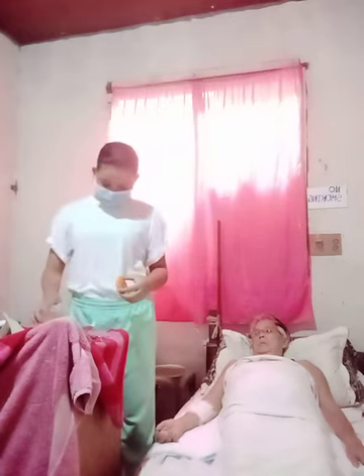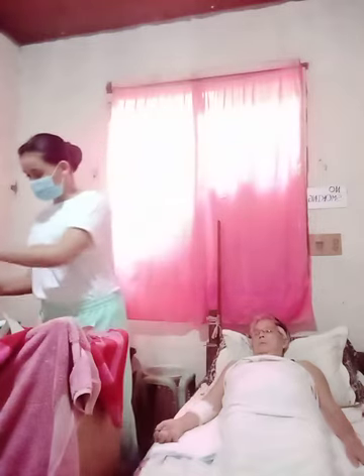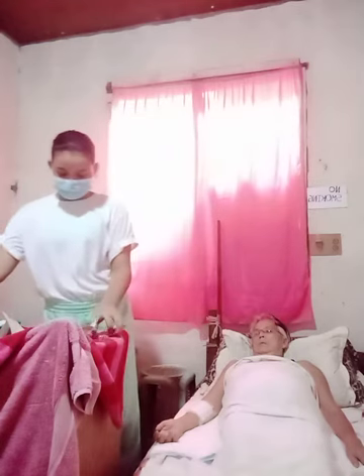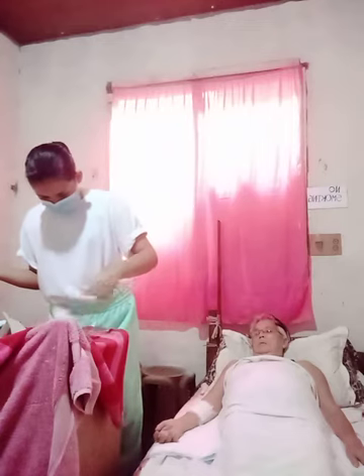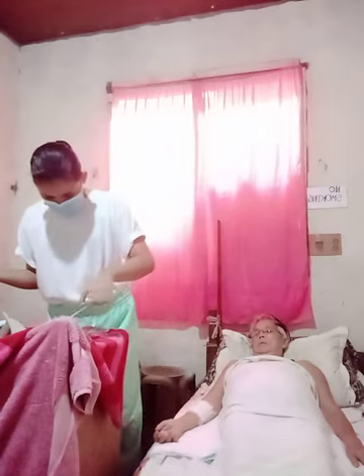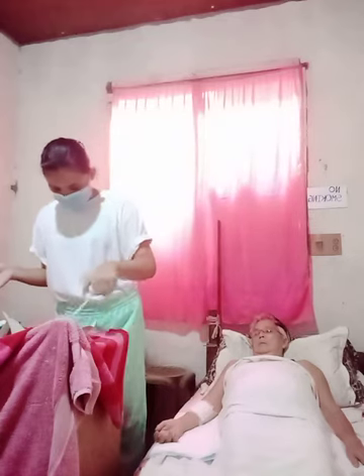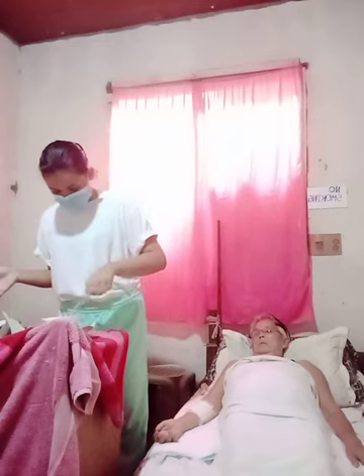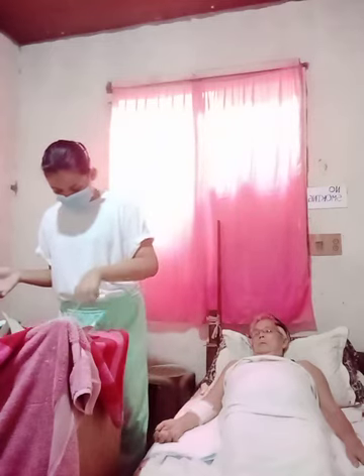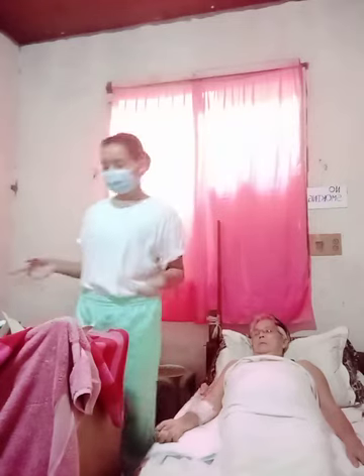This is the normal saline. I'm going to add 2. Then next is to apply sterile gloves.